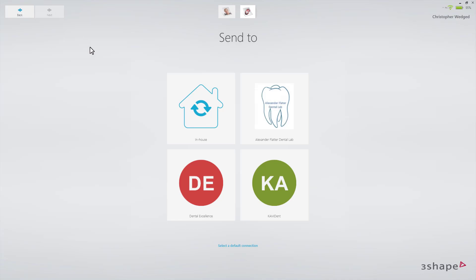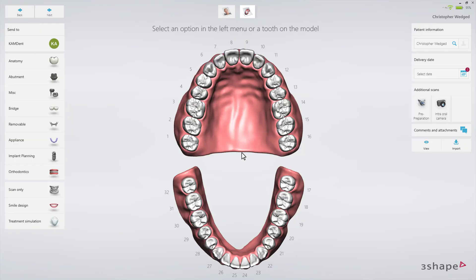Select the lab. If you have only one lab, this lab is automatically pre-selected. The order form will appear.